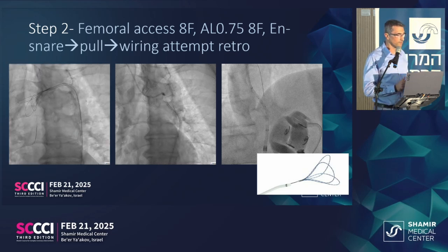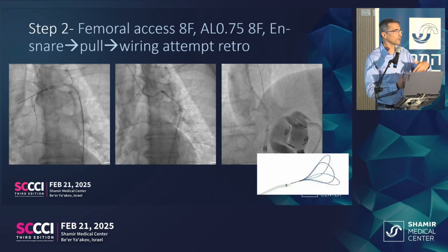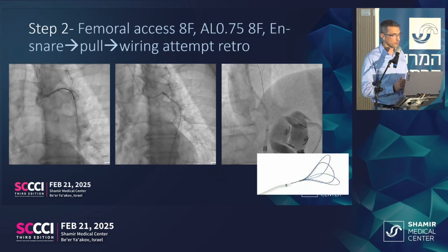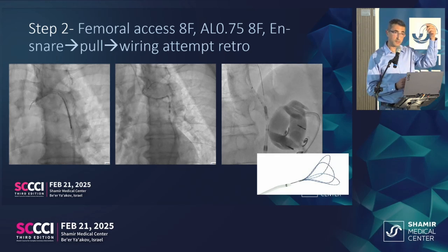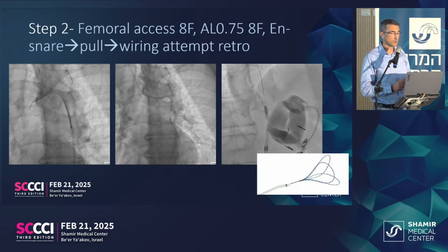And then we advanced and rendezvoused the two catheters in order to bring the stent closer to the femoral access. We were also able to, or at least try to, rewire retrogradely in order to do the same thing: try to rewire retrogradely and pull the stent with the balloon towards the femoral access.